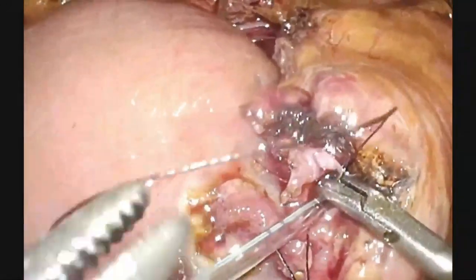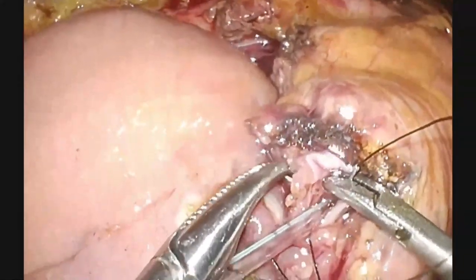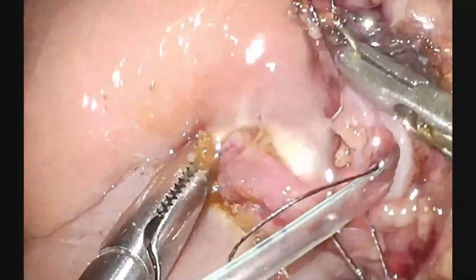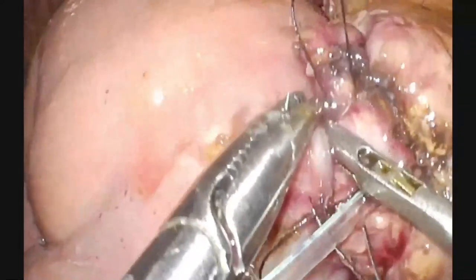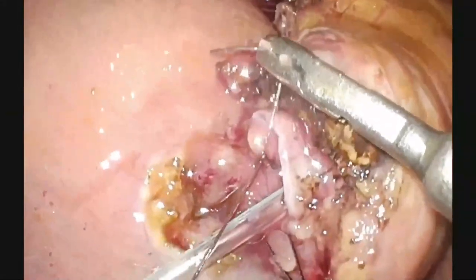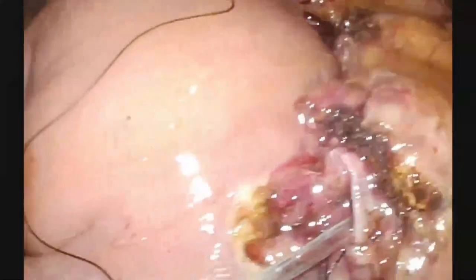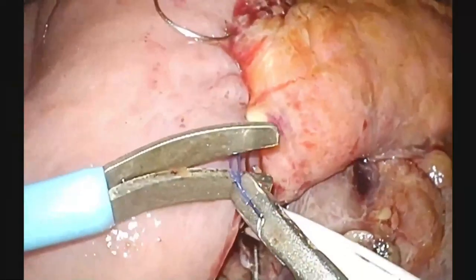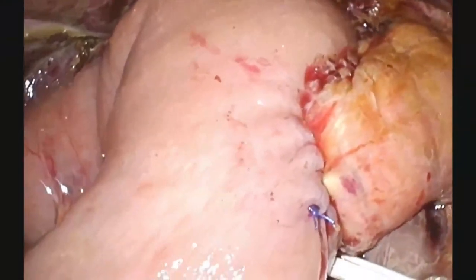A pancreaticojejunostomy in two layers is done. The posterior layer has been constructed, and now a duct-to-mucosa anastomosis is being built. A stent on the pancreatic duct is used only to facilitate stitching at the duct-to-mucosa anastomosis, but will then be removed. Each stitch is placed under direct visualization, assuring a watertight closure. An anterior seromuscular layer with a running monofilament suture completes the pancreaticojejunostomy. The gastrointestinal tract reconstruction is done through a postpyloric duodenojejunostomy.